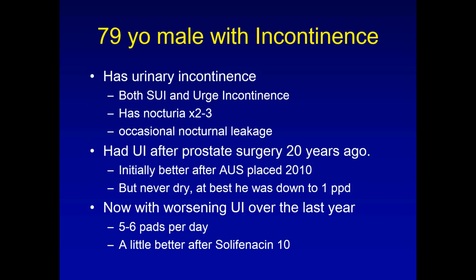If you have anybody who's had an artificial sphincter placed, you know that they are often very happy. I think this guy must have mental disease because he thinks I walk on water, mainly because that sphincter works so good. He loves me. Until this year. This year he comes in saying, Doc, I still love you, but I'm leaking again. I think your sphincter's broken.